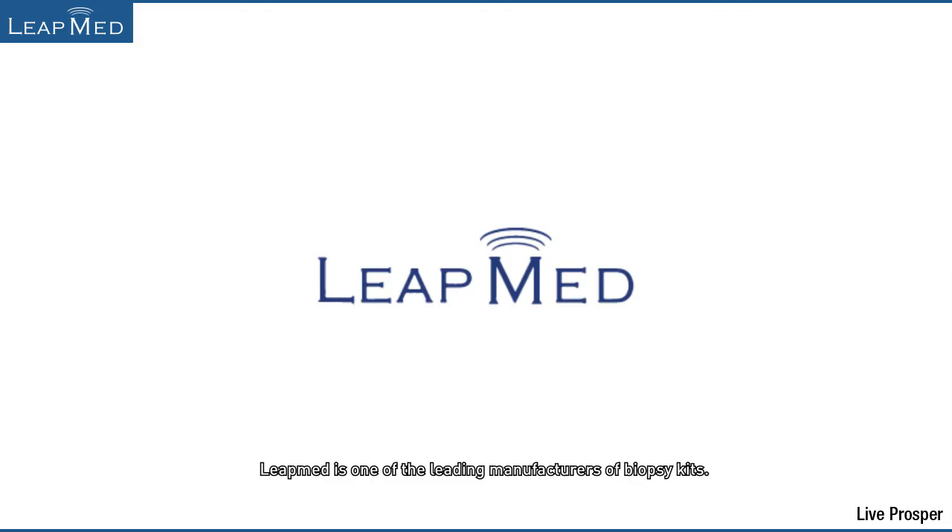LeapMed's products have been approved by the CE, by the CFDA, and by the ISO organizations. LeapMed is one of the leading manufacturers of biopsy kits. We hope our range of products will help you achieve great success during your interventions. You are welcome to contact LeapMed for free samples.